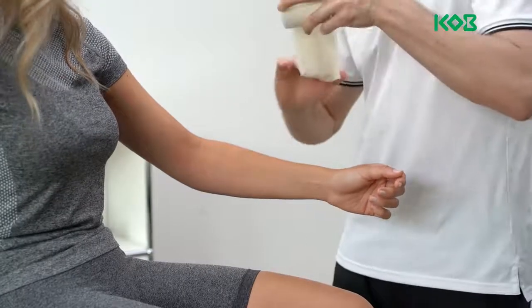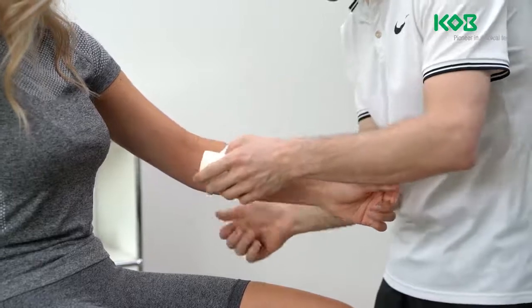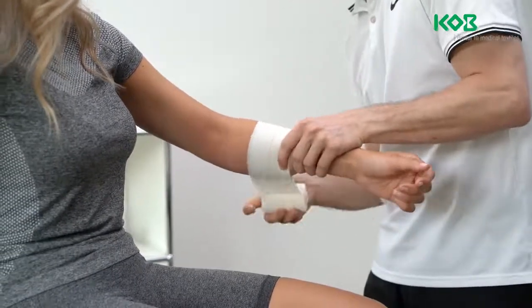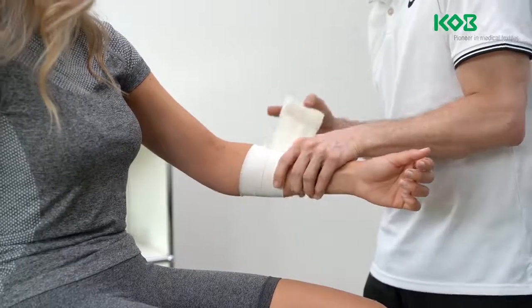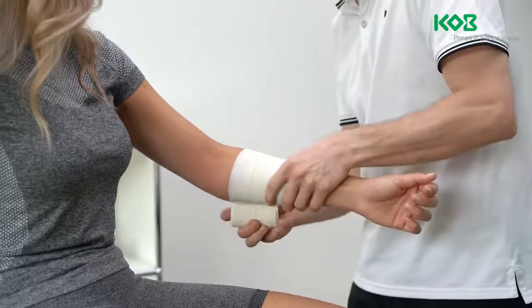Unroll the bandage a little before the application. Apply the bandage to the affected side with moderate tension. The elbow is slightly bent. Start by applying the dressing below the elbow joint and apply several laps, moving up to the middle of the upper arm.